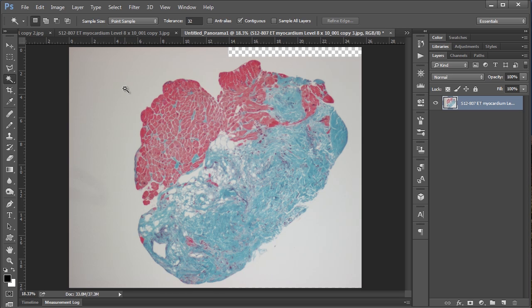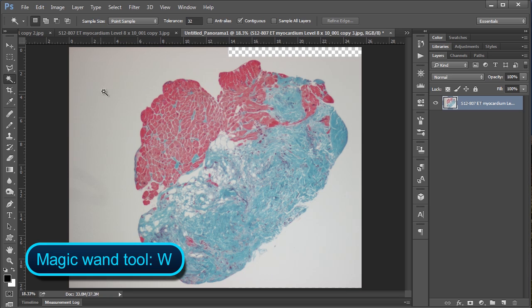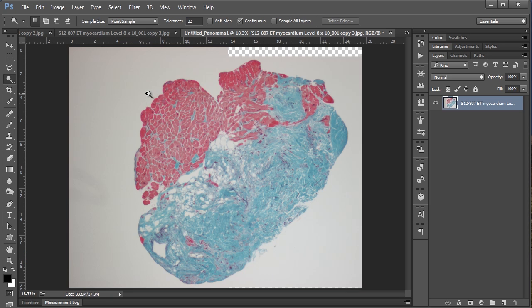So for now the next step we want to do is actually select the biopsy. And after tinkering around for a while I found that really the best tool for this or the easiest tool is just the magic wand tool, which you can get to by pushing the W key. And so with the wand tool you just want to click. Oh I should note the settings up here. First of all we want to create a new selection. Point sample is fine. The tolerance of 32 which is the default seems to work fine for this particular image.